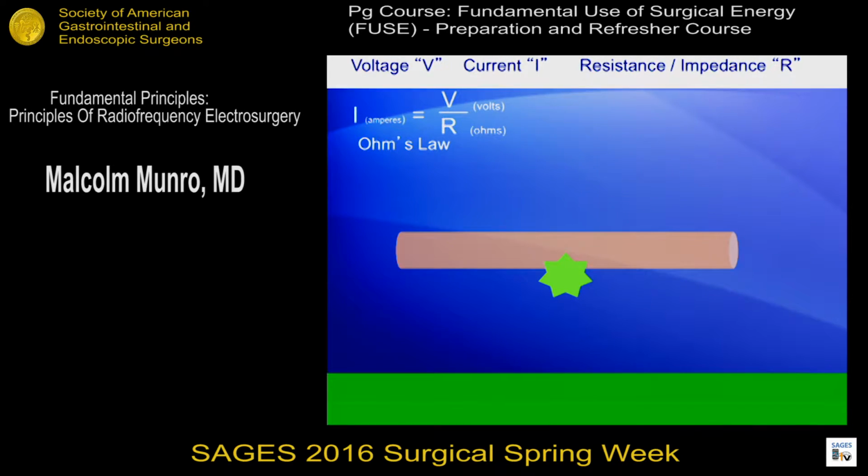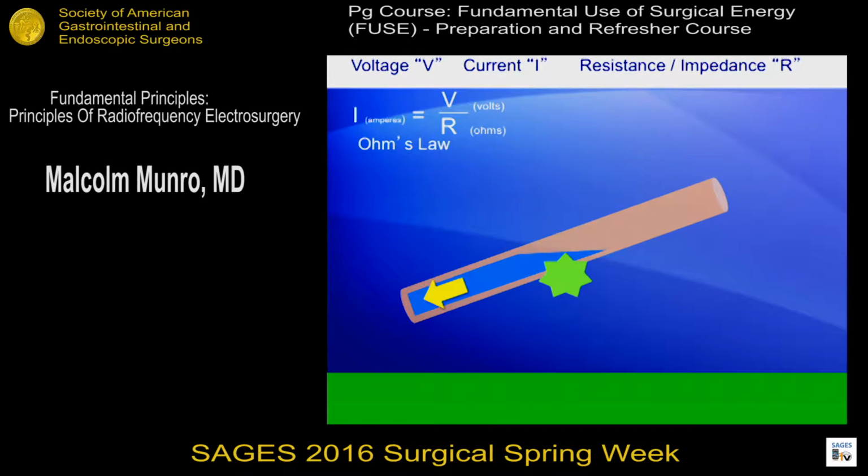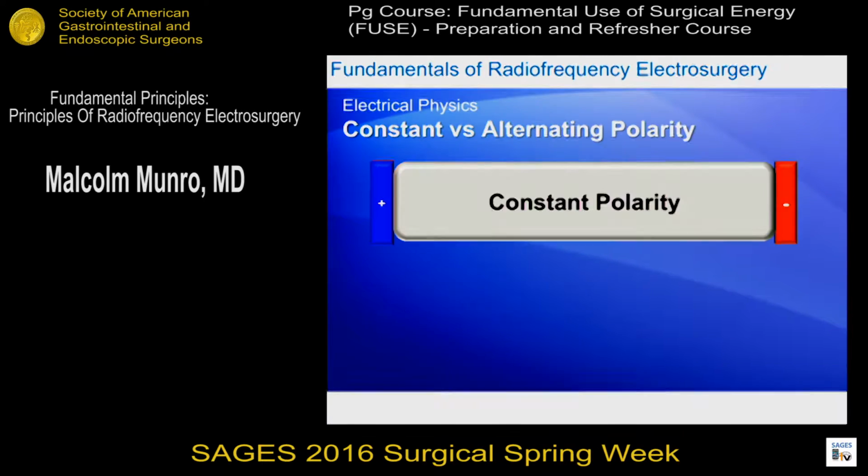Now, remember I told you we're actually using alternating current. And what does alternating mean? It's alternating polarity. So this is another metaphor that we came up with. This is a tube filled with water, and there's a little wheel there that generates power. So if we tip that wheel one way, we'll tip the tube one way, we'll spin the wheel. If we tip it another way, we'll spin it. And we can go back and forth like this and end up creating output without any real movement of the water in a circuit fashion.